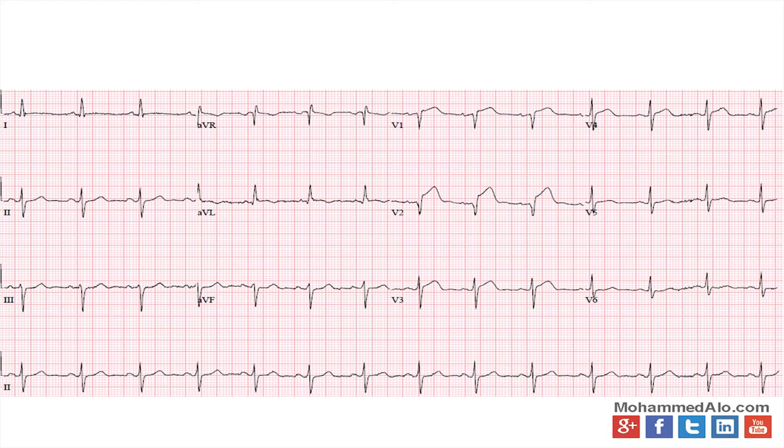Normally, in an anterior acute MI, your V4 R wave is under 11 or under 13 millimeters. In this case, it's definitely under 13 millimeters. That's usually diagnostic of an acute anterior MI, as long as you have all the other regions. Now, this guy is not even complaining of chest pain. It's probably just persistent ST elevations. He comes in saying, ouch, I have chest pain. You're calling the cath lab and starting him on all the proper medications.